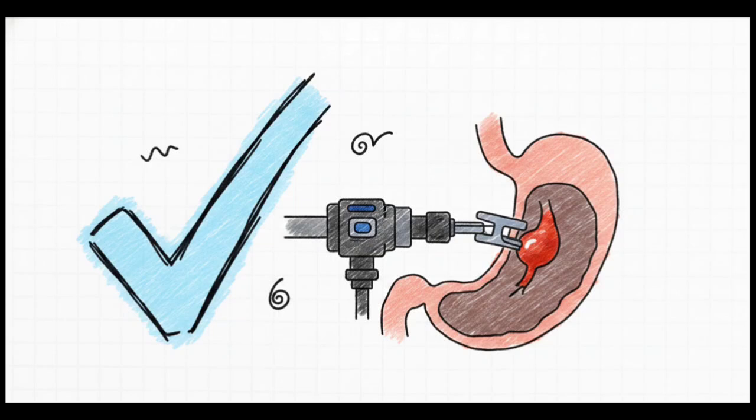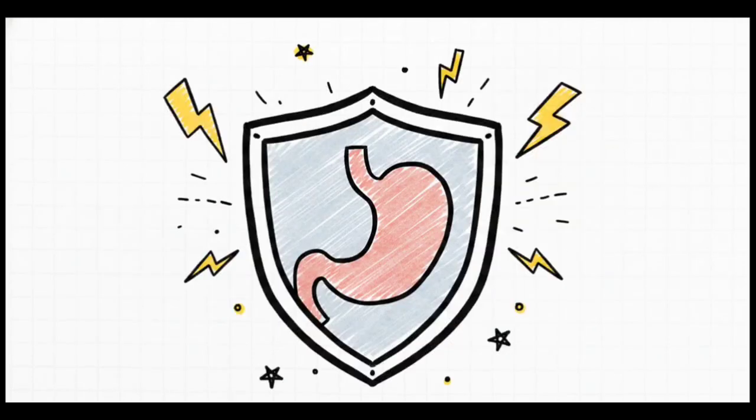Got it? Exactly right. It's Forrest 2A. And because you didn't fall for that trap we just talked about, you correctly identified it as a high-risk lesion that absolutely mandates endoscopic hemostasis, utilizing techniques like injection, thermal, or mechanical therapy. By mastering these specific distinctions visually and conceptually, you've pretty much just bulletproofed your GI emergency knowledge. You now know exactly what a spurting vessel versus a flat pigmented spot means for your patient's immediate future.